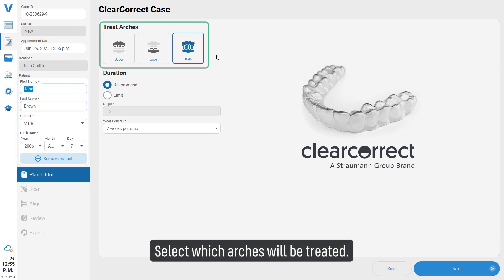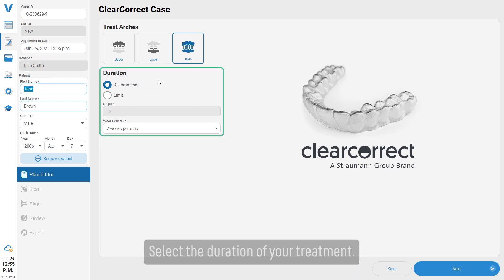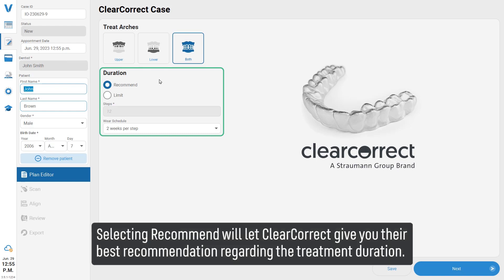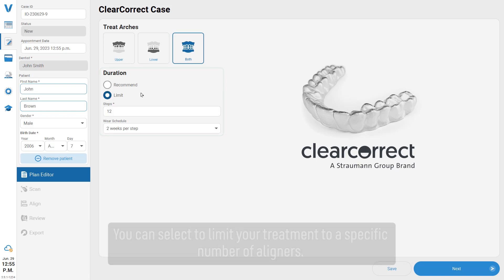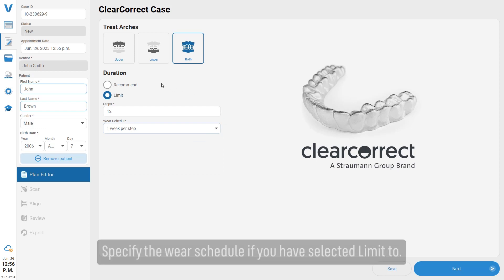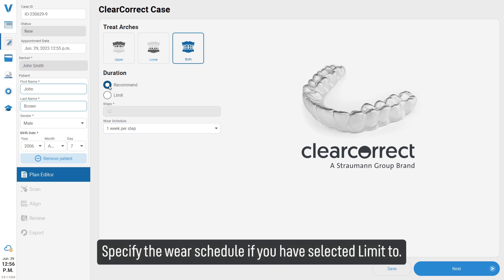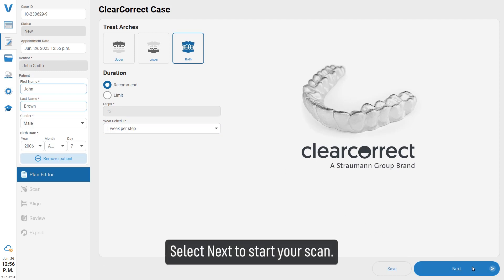Select the duration of your treatment. Selecting Recommend will let ClearCorrect give you their best recommendation regarding treatment duration. You can also select to limit your treatment to a specific number of aligners. Specify the wear schedule if you have selected Limit. Then select Next to start scanning.